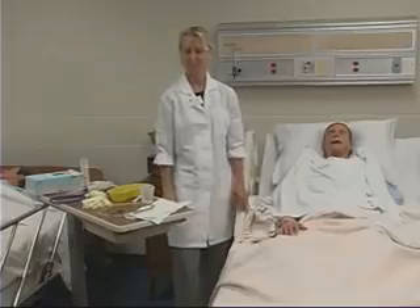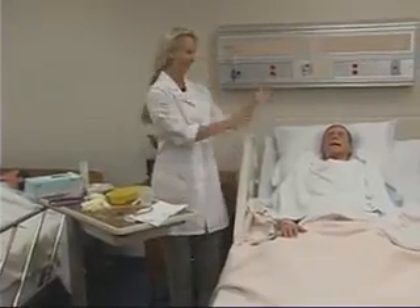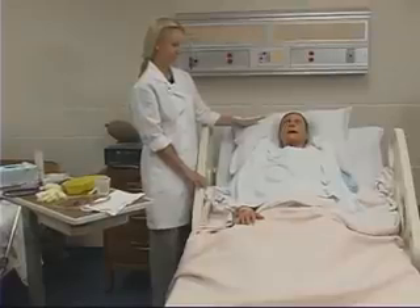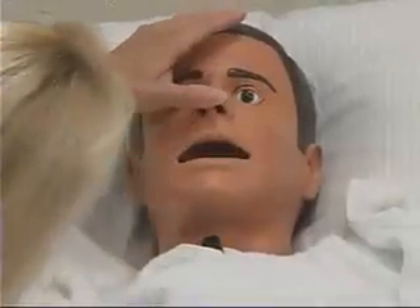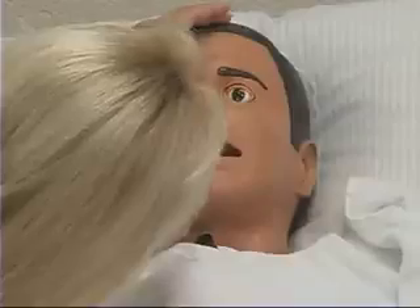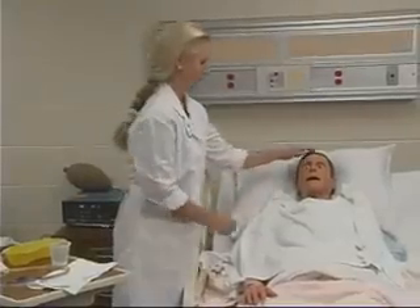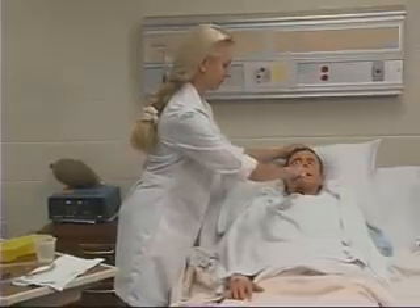To insert the nasogastric tube, begin by washing your hands and elevate the head of the bed between 45 and 90 degrees. Inspect the client's nose to select which nare has better air flow. You can use a flashlight to perform this. Ask the client about any deviated septums or previous injury or surgery, and check the ability to breathe through both nares by occluding one at a time.